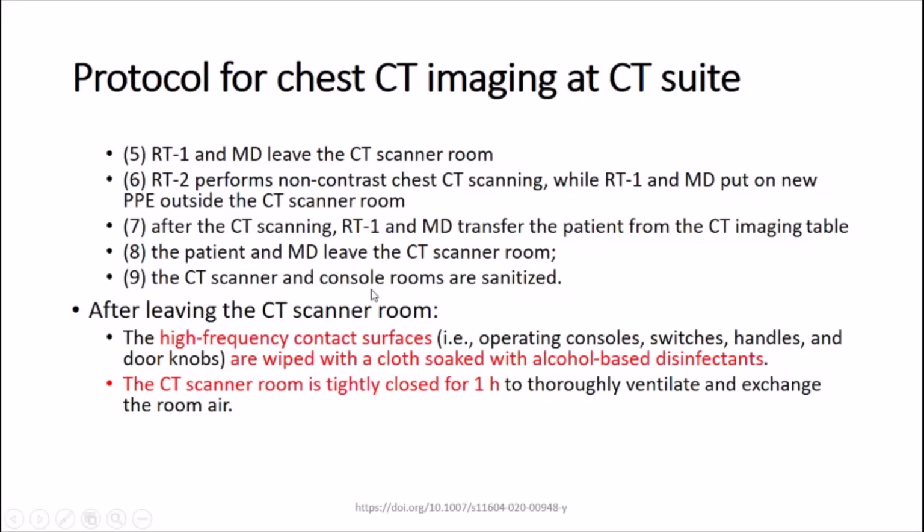The CT scanner and console rooms are sanitized, as I mentioned in the previous slides, by wiping all the surfaces with alcohol. It is also suggested that after the patient leaves the CT scanner room, if you have negative air pressure, the room should be closed for one hour so that the air will be recycled. But in some recommendations, like the expert panel in RSNA, they say to just leave the door open passively for the air to change, also for an hour.